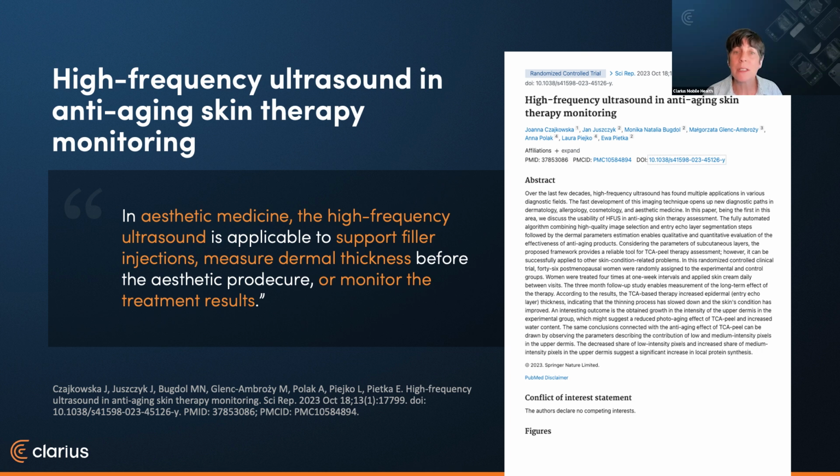Great. Now, this paper talks about new applications for ultrasound use that include dermatology and aesthetic medicine. As we know, in aesthetic medicine, high-frequency ultrasound is applicable to support filler injections, measure dermal thickness before aesthetics procedures, or monitor treatment results. The authors also discuss ultrasound use for skin aging assessment, and Dr. Ravera will be showing us some skin ultrasound in her presentation, so you'll be able to see the value of learning ultrasound anatomy of the layers of the face, including the skin.